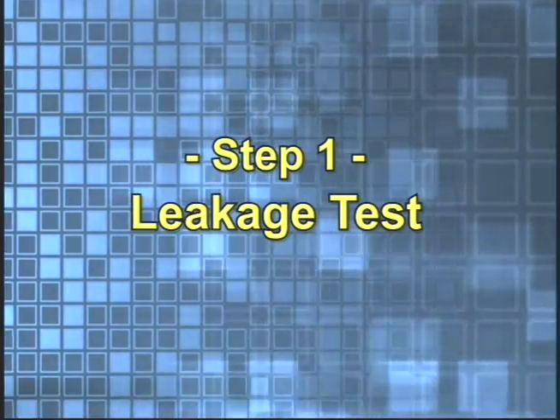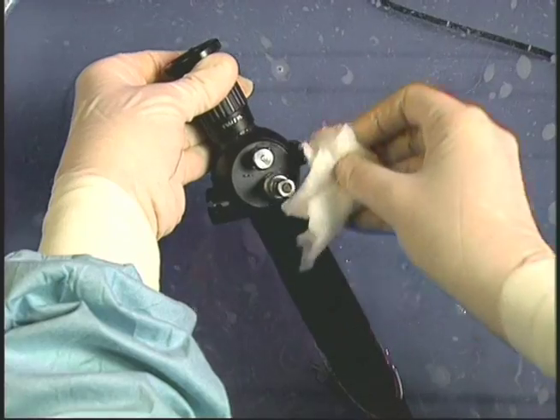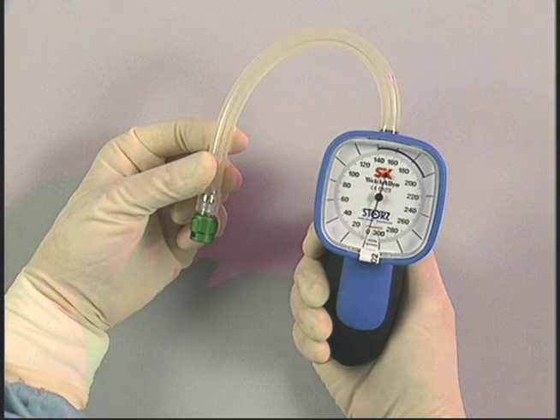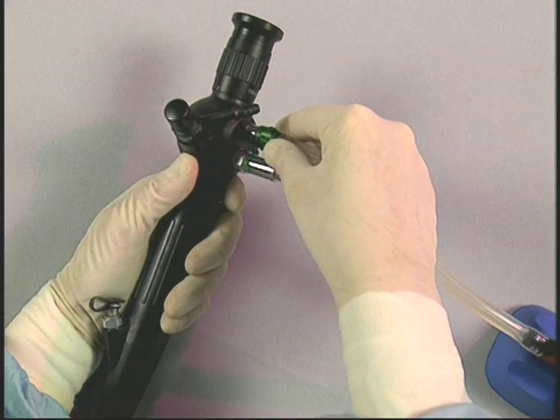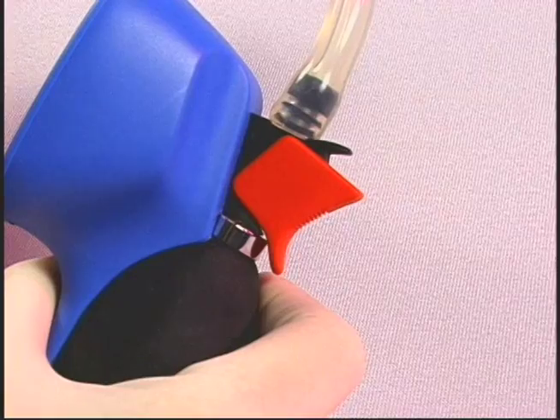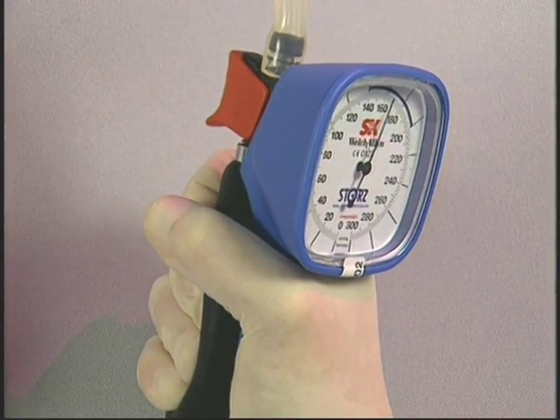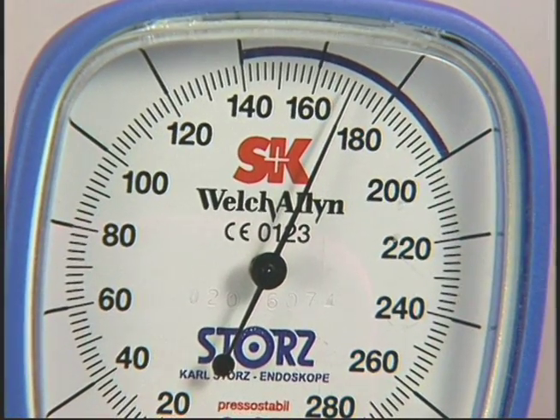Step 1: Leakage test. A leakage test must be performed before cleaning the scope. The leakage tester is provided to verify its watertight integrity. A hand-operated bulb provides air pressure. Connect the end of the leakage tester tubing with the green bayonet fitting to the vent port on the endoscope. The red pressure release valve must be in the closed position. To pressurize the endoscope, squeeze the hand-operated bulb until the indicator needle rests in the blue zone.